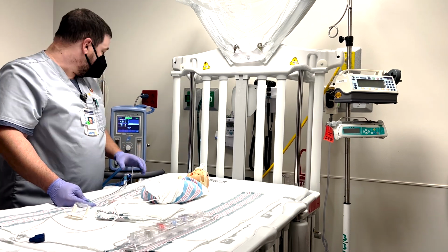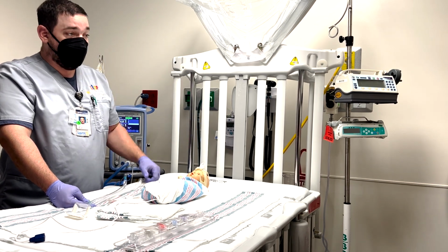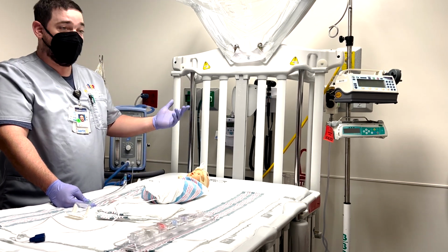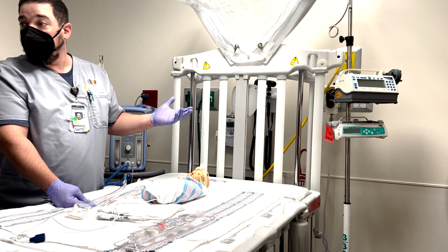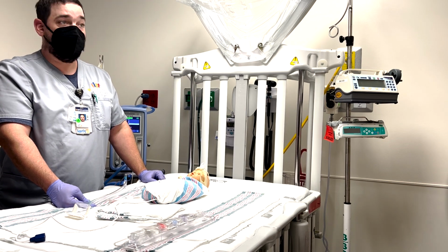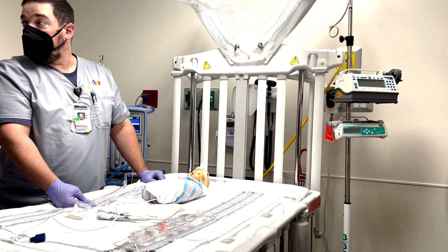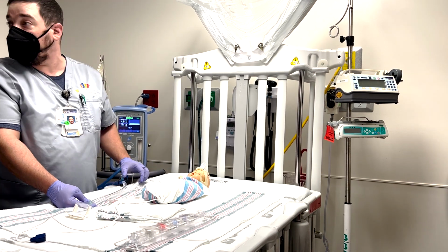Because 5 and 21 is pretty much the lower limit. If the next move is we take them off, because we know that normal physiological PEEP for an adult is 3 to 5. What is it for a baby? 3 to 5? Yep. It does not change no matter how big you are.